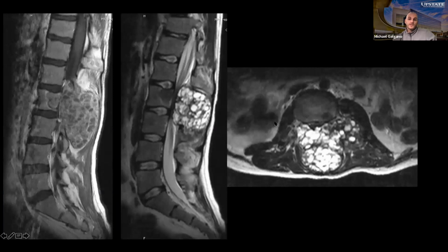So here's the MRI scan that we had. I'm not sure who's on here. Is Rasuli on here? You want to take a jab at this, Jonathan? No? All right. What do you guys think? Alex, what do you think if this guy walks into your clinic, 23-year-old with progressive neurogenic bowel and bladder and leg weakness? This is all extradural though, Alex. This is all you, buddy.